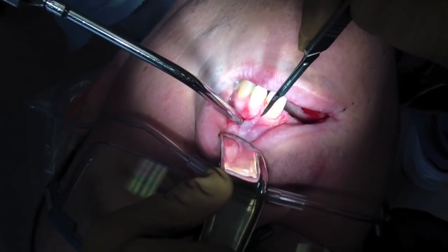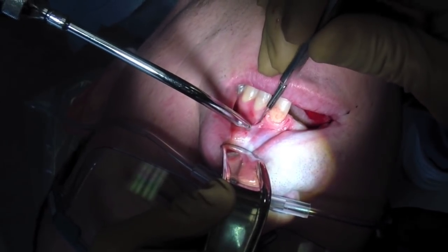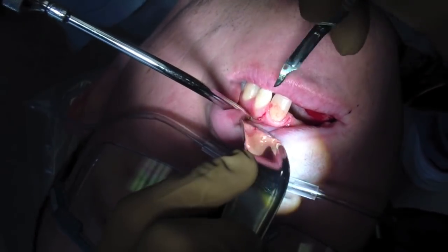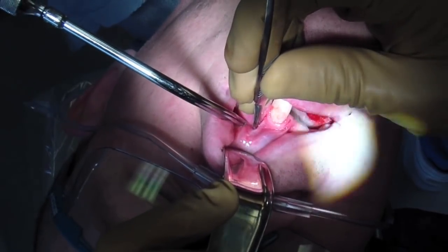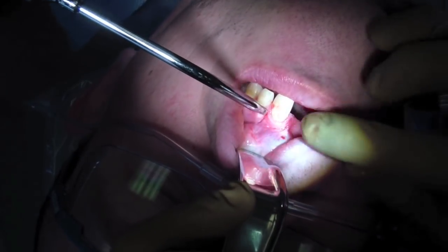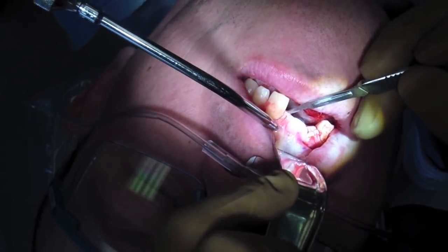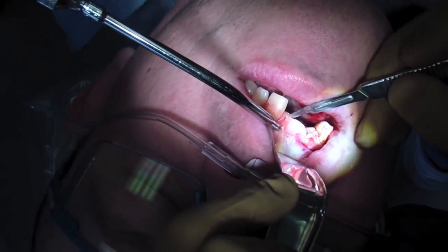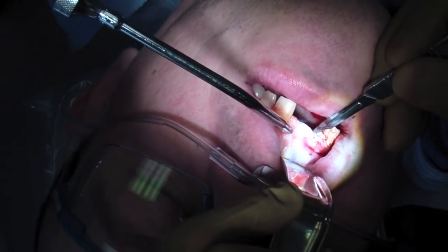This video is going to be showing you just the primary incisions. What I'm doing here is a vertical releasing incision all the way to bone, through periosteum. And we take it beyond the mucogingival junction. That's on the distal buccal of the central incisor. We're going across the osseous ridge, osseous crest, and then distal buccal of the canine.